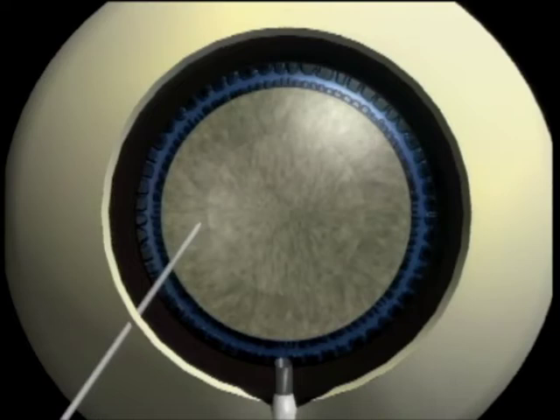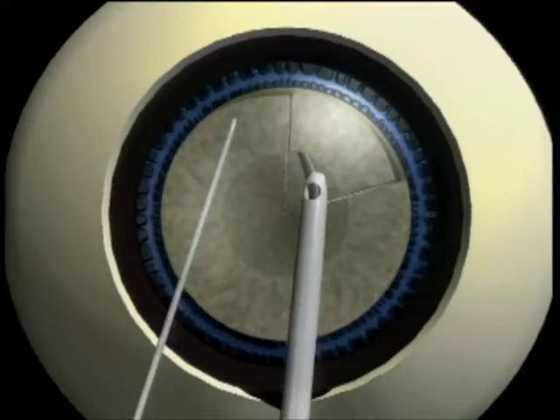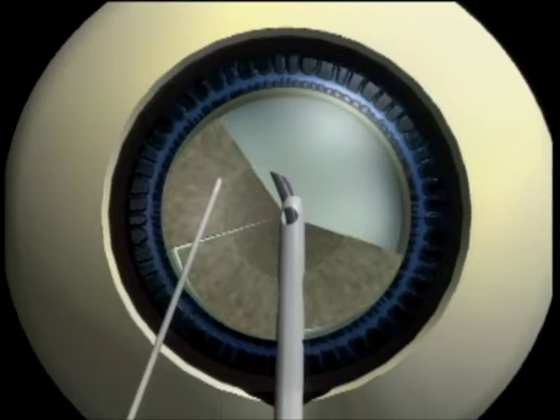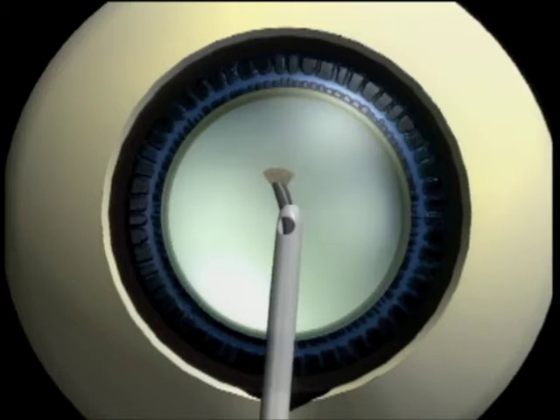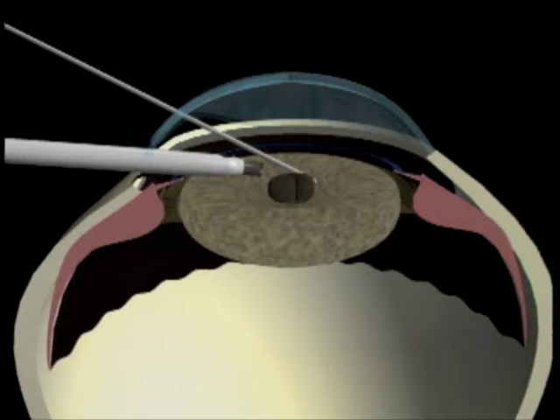The technique starts by cratering out the central core of the lens while stabilizing the nucleus with the second instrument. Then the nuclear rim is fractured into multiple sections, and these sections are brought to the center for safe emulsification. On this cross-section we will again note the central coring of the lens to form the crater and debulk the lens.